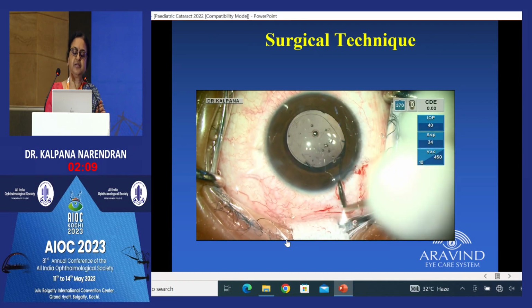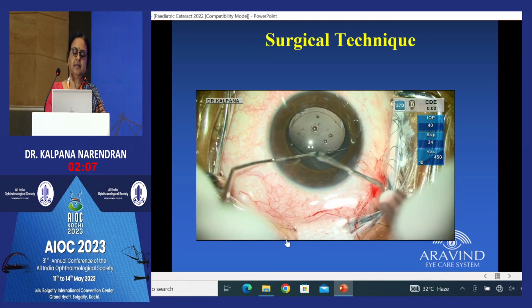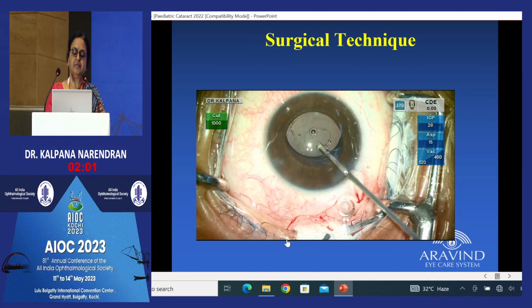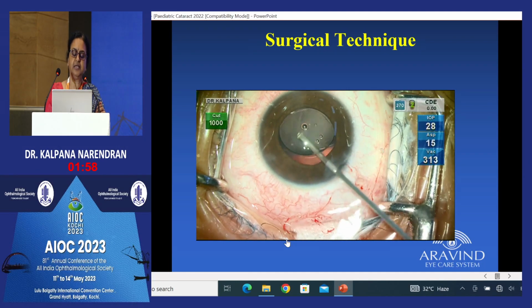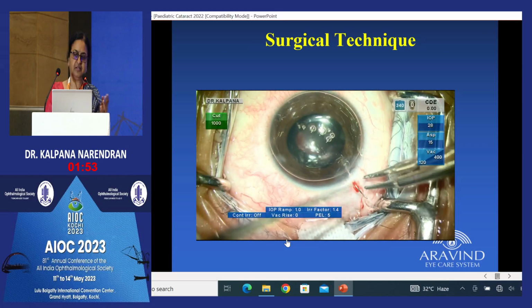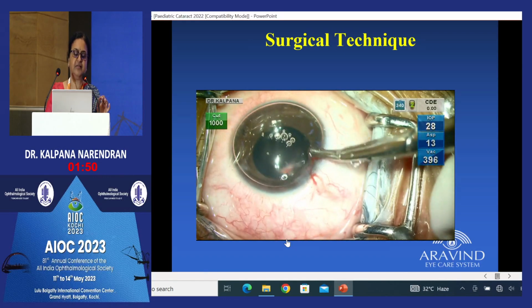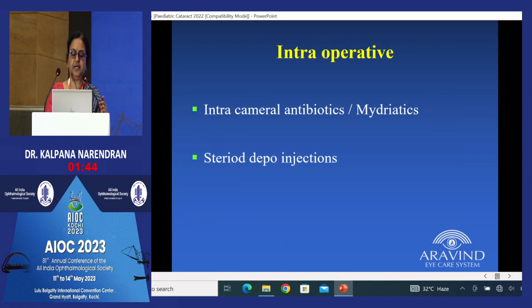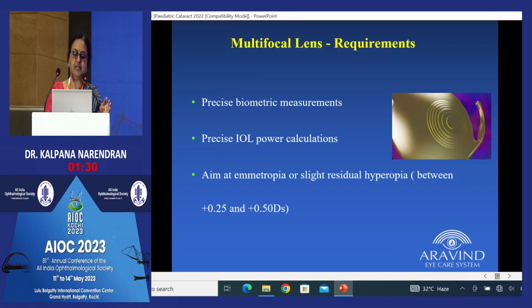and primary posterior capsulotomy, again with the cystitome, and then complete the posterior capsule rhexis, and do an anterior vitrectomy, and the wound is closed with a 10-0 Vicryl suture, which you do not have to remove. Sometimes what happens is there are some deposits in that, and the child gets some irritation, or it might form an infection, then you go ahead and remove it.